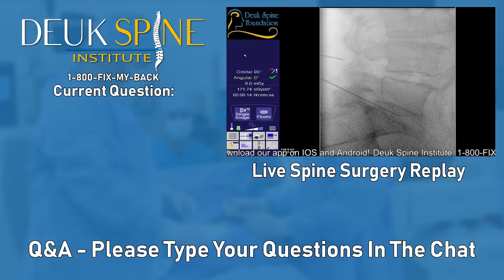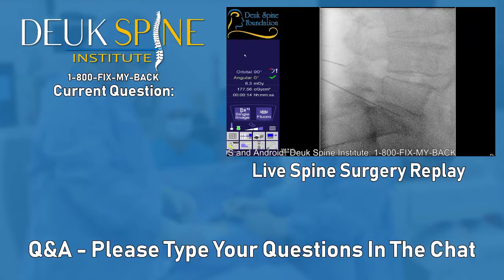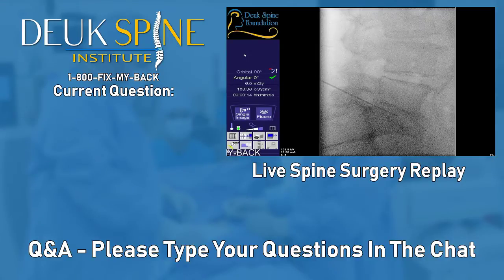Okay, Dr. Deuk Magent here with you, and for those of you who watched the whole surgery, we performed a Deuk laser disc repair, L34, L45, L5S1 through a left side approach. The patient had left leg symptoms, and if people have left leg symptoms, I go on the left side of the lower back. If they have right leg symptoms, I go on the right side. If they have both legs, but one is dramatically worse than the other, I go to the side where the symptoms are the worst for the lower back.